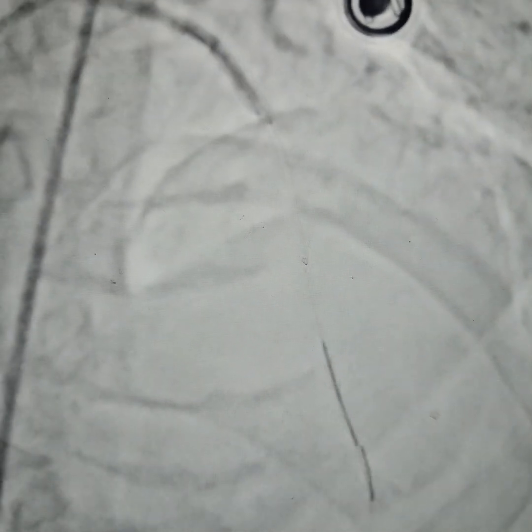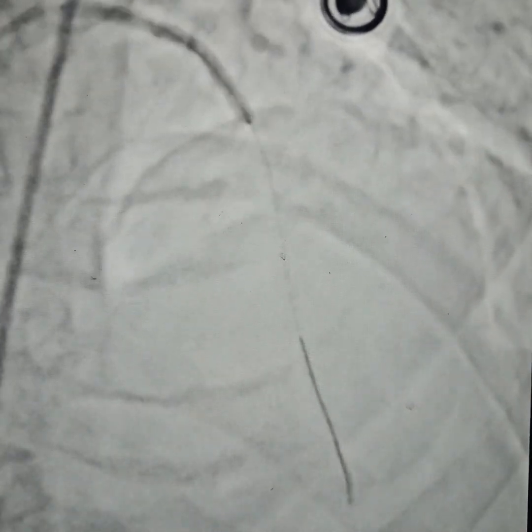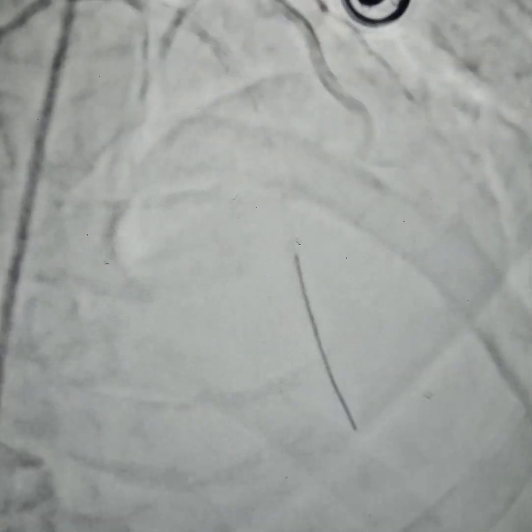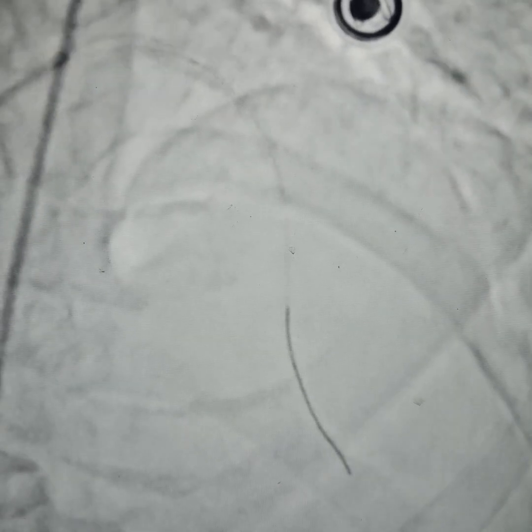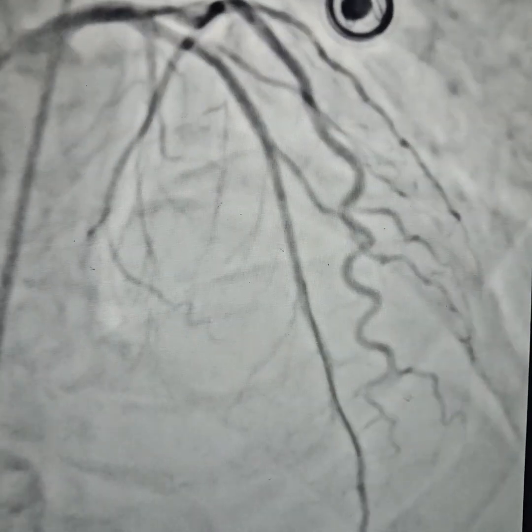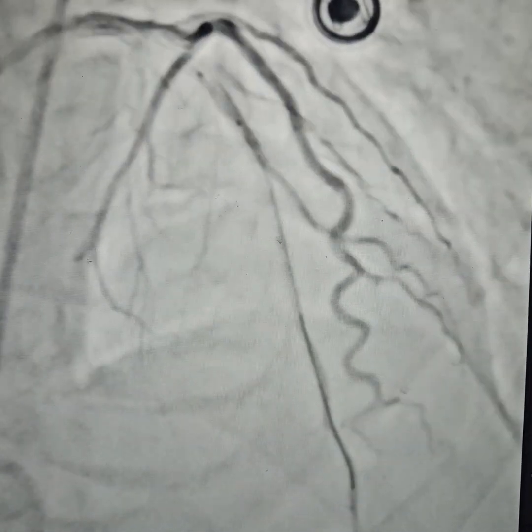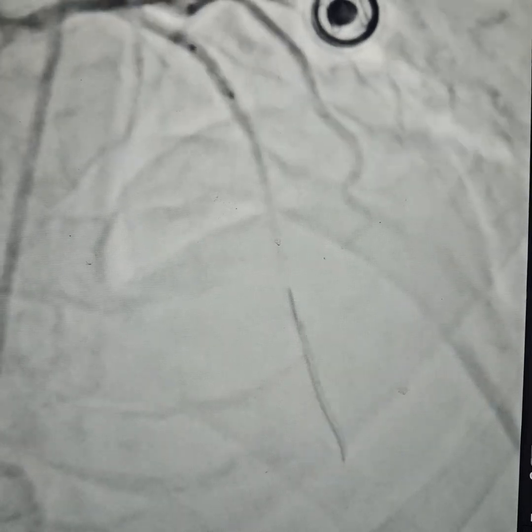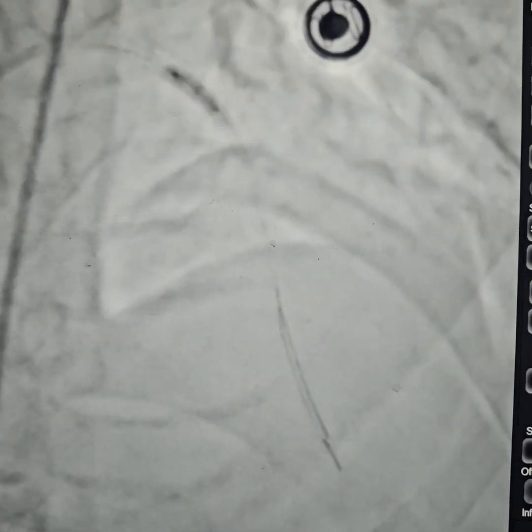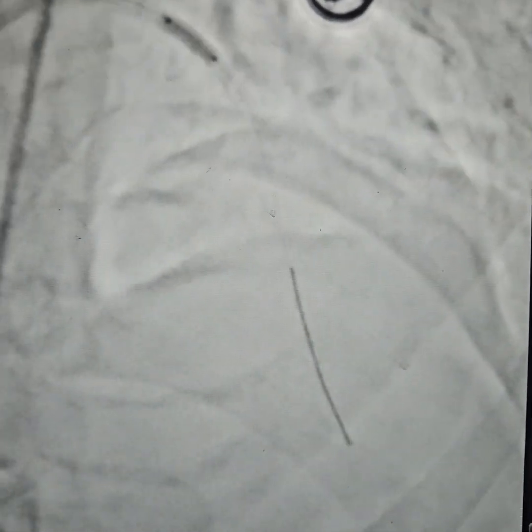You can appreciate the slow flow in the previous slide. This is the stent being opened up, and the flow has immediately improved. We always go for aggressive post-dilation. First we post-dilate with the stent balloon only, because flow has been achieved — the TIMI 2 flow has resolved to TIMI 3 flow. This is the most under-expanded segment, and we are post-dilating aggressively using the 3.5mm by 12mm balloon.